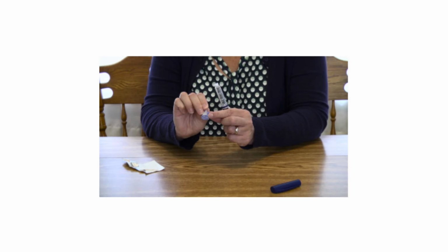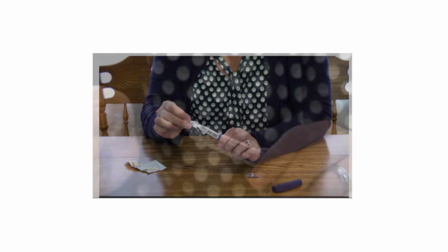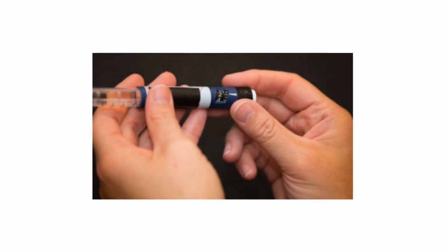Take a needle and remove the plastic covering on the base. There are various lengths of needles. This will be prescribed by your doctor. Align the base of the needle onto the pen and twist it until it sits snugly on there, but not too tightly. Then remove the protective cap from the needle itself.